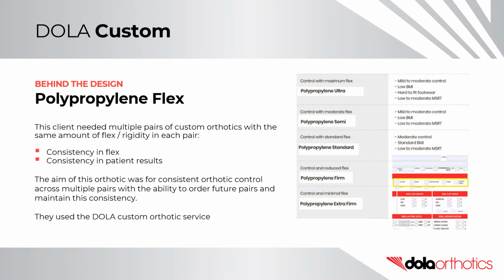Behind the design, polypropylene flex. This client needed multiple pairs of custom orthotics with the same amount of flex or rigidity in each pair. They required consistency in flex for consistency in patient results. The orthotic aim was for consistency of orthotic reaction force and control across multiple pairs, with the ability to order repeat pairs and get the same result.